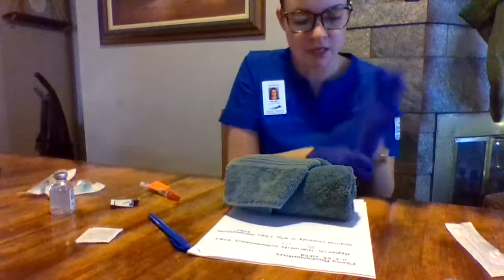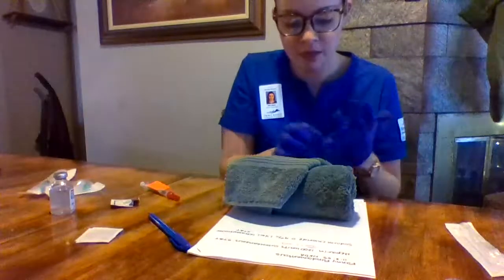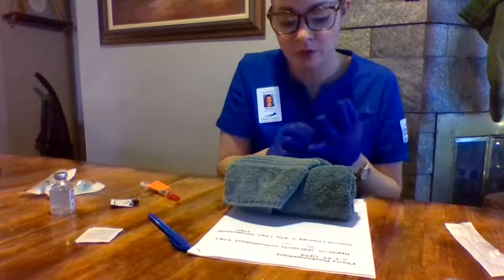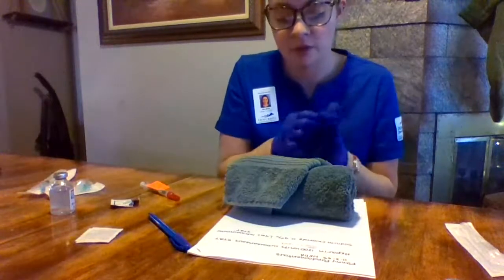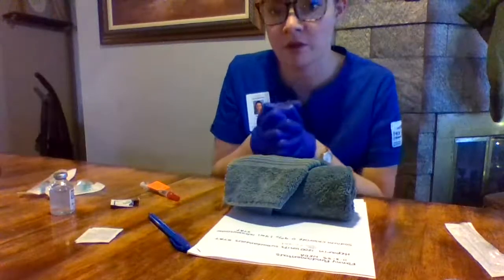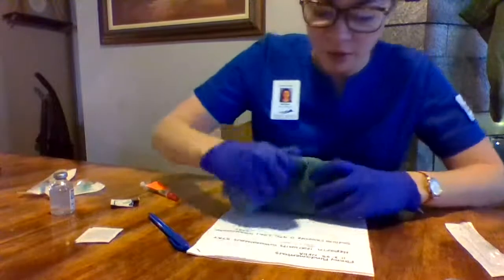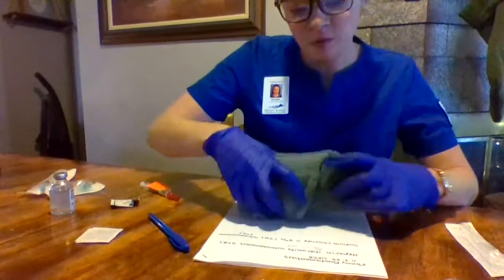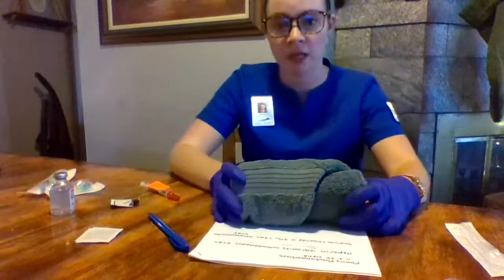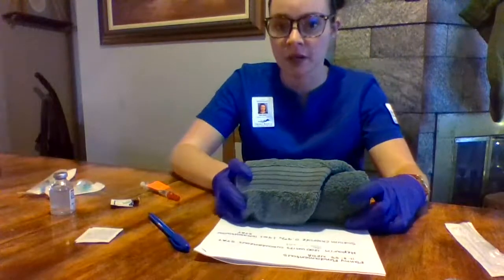For subcutaneous, we can do it on the abdomen, the back of the arms, underneath the scapulas, or the lateral or posterior thigh. For this, we're going to be doing it in the abdomen. We will stay 2 inches away from the umbilicus and 1 inch away from any contusions, tattoos, injuries of any kind.